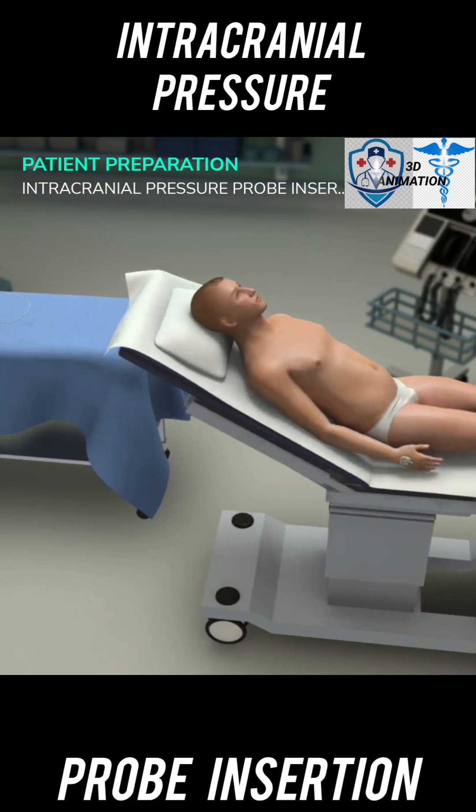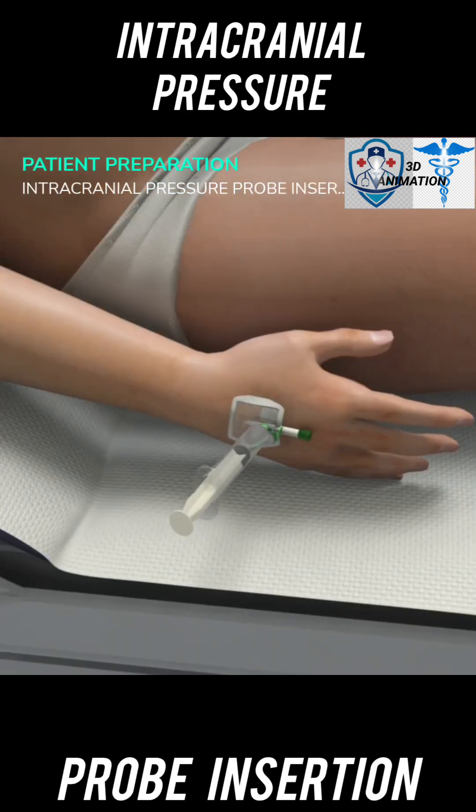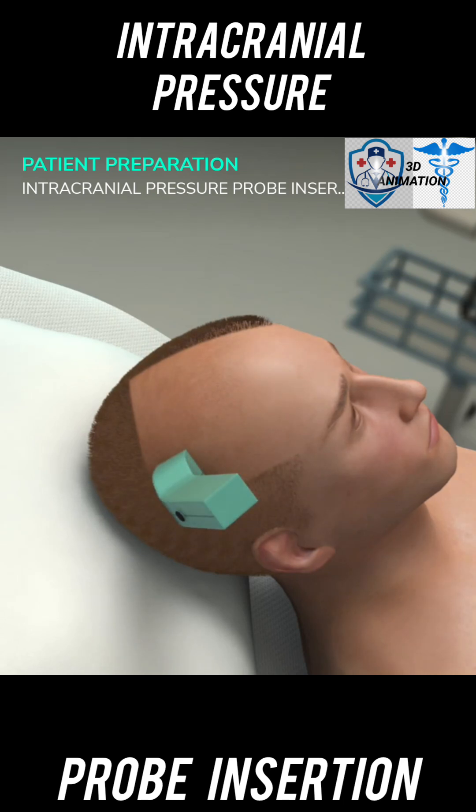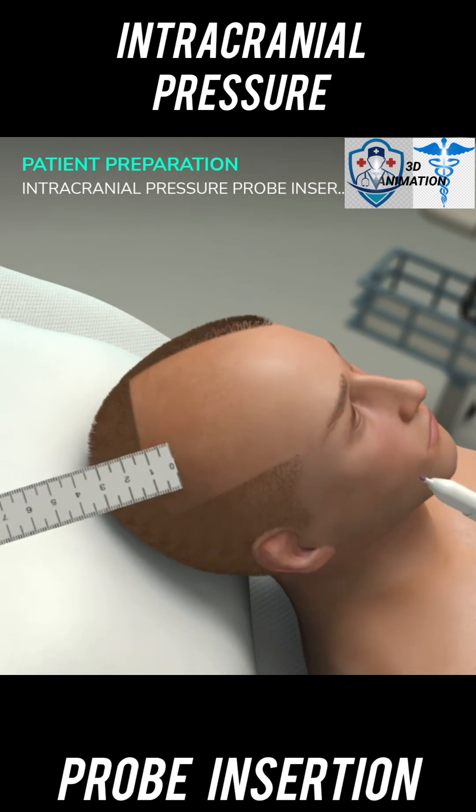Elevate the head of the bed to 30 to 45 degrees. If needed, administer IV injections to the patient. Use the clippers to shave the frontal portion of the scalp. In this case, the right side has been chosen.